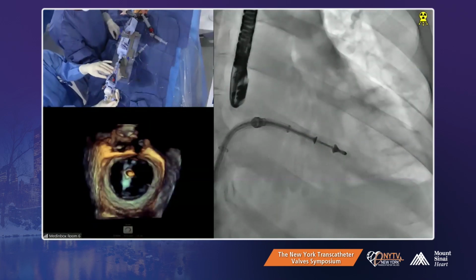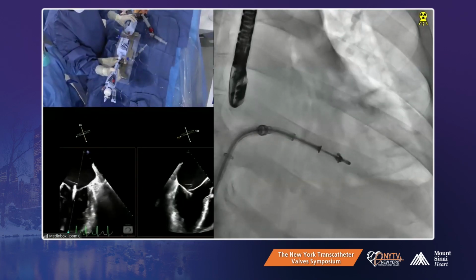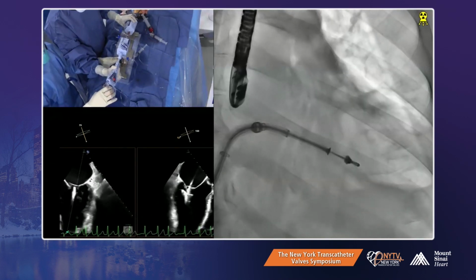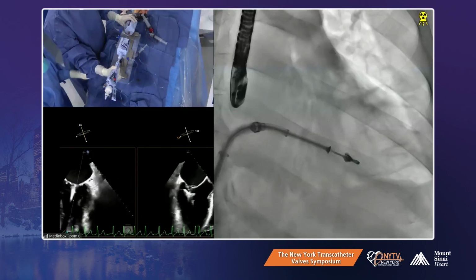That looks better there. Now we are more lateral than medial. That's quite lateral. That is definitely quite lateral. That's the most lateral you've been. Well, sometimes you have to start lateral. We can, if you want to. I mean, sure.